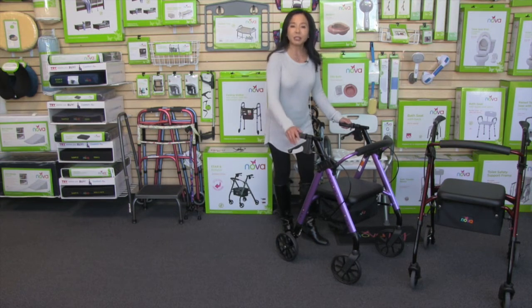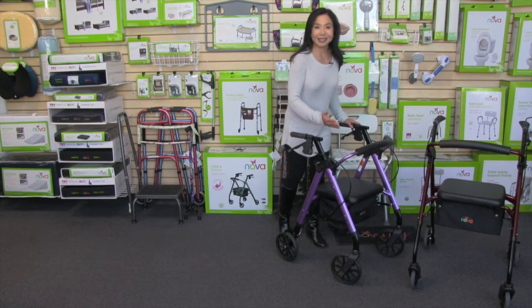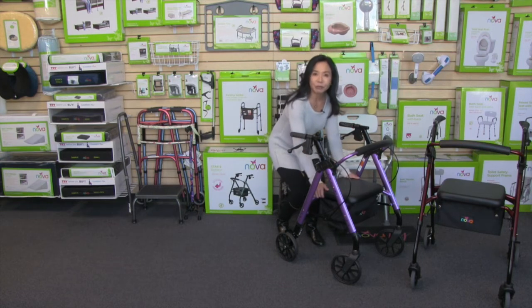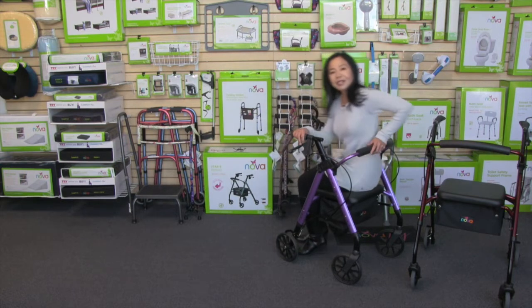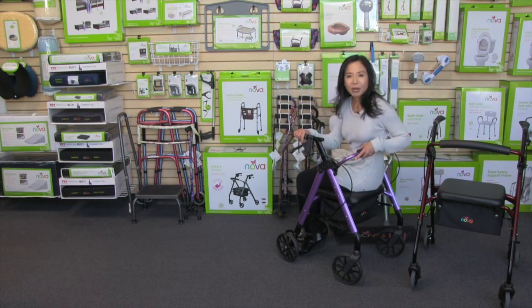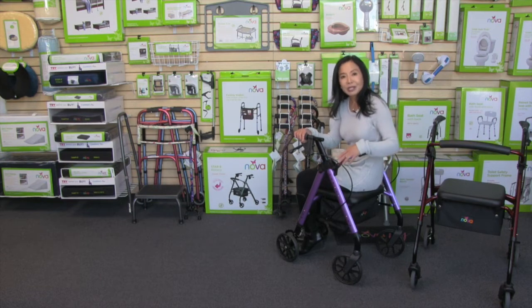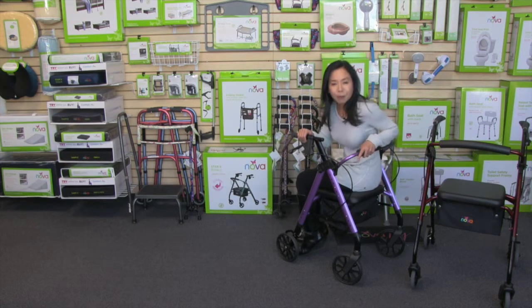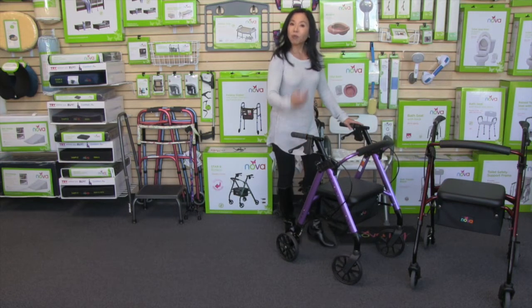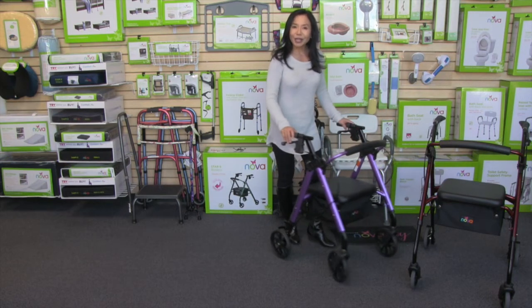And it's in this position that you want to use the seat. So we've got a very comfortable padded seat, and now that the walker is parked, I can sit down, and also a very comfortable backrest. So you'll notice that with the lower seat height, this is a great seat height that's very comfortable for me. And you always want to make sure the brakes are in a parked position the entire time you're seated and no scooting. All right, with the brakes parked, I can get up, and then when I'm ready to go, release the brakes, and I'm ready to roll.